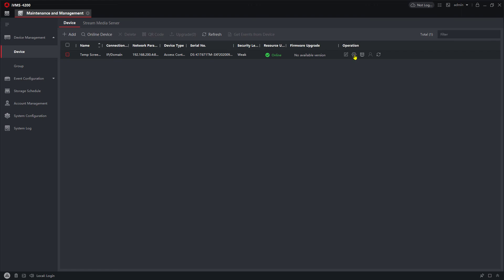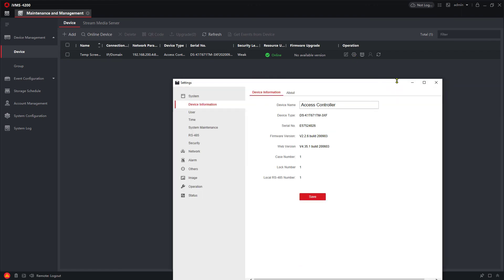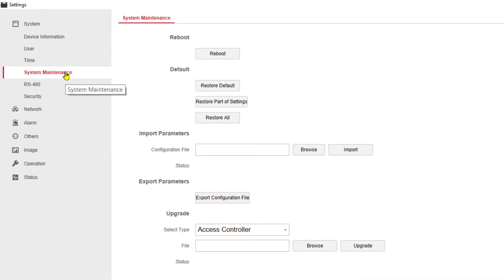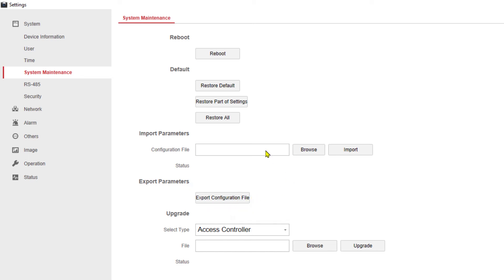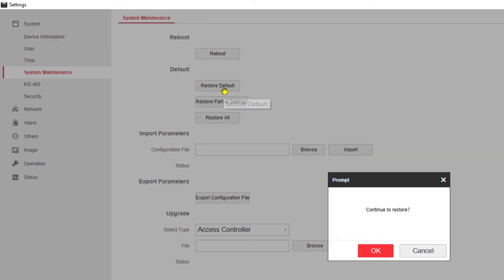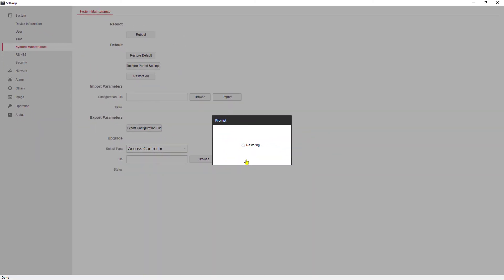We'll go into the remote configuration, system maintenance. But before I actually click on restore defaults, if it's a device that has heavy configuration already done to it, I'm going to export the configuration file and I'm going to save that somewhere, and that way I'll be able to import that configuration file back in later. But what I want to do at this point is I want to go ahead and restore the defaults. Now this will restore everything except for the IP address that you may have already set into the device.